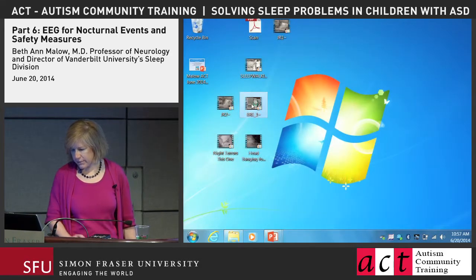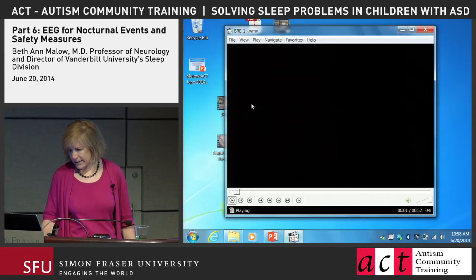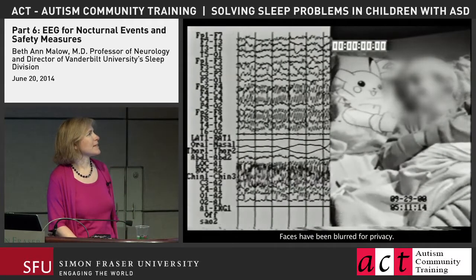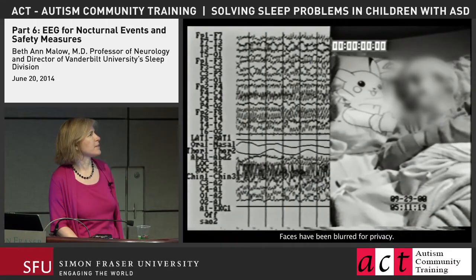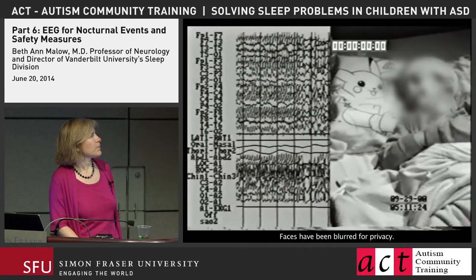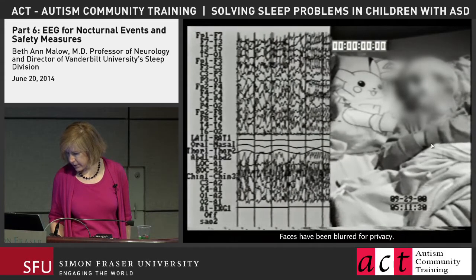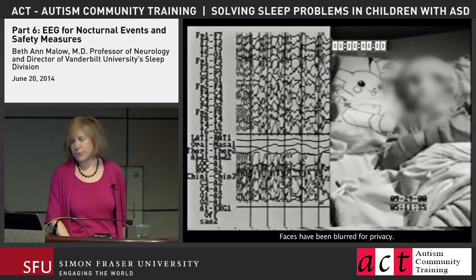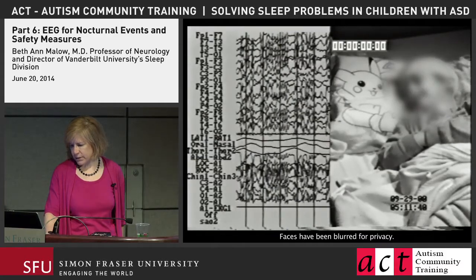This is an example of another type of epilepsy called benign Rolandic epilepsy. And the benign part is they oftentimes outgrow it. The Rolandic refers to the part of the brain that controls movement of the face and motor areas, and you can hear it as well as see it. You see that movement of his mouth. And they're very short, and we were lucky enough to capture it. He had actually come in to rule out sleep apnea, and he had one of his typical seizures while he was here.